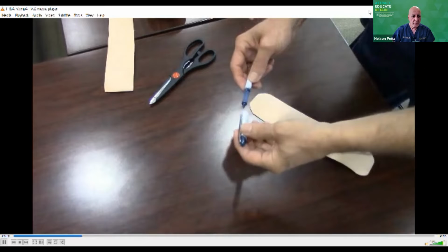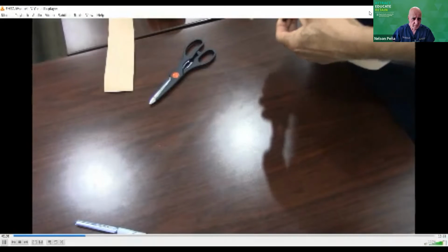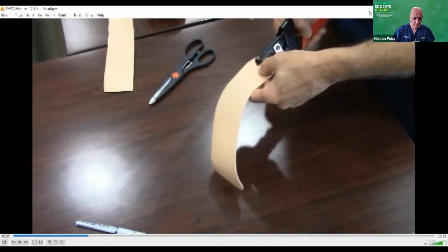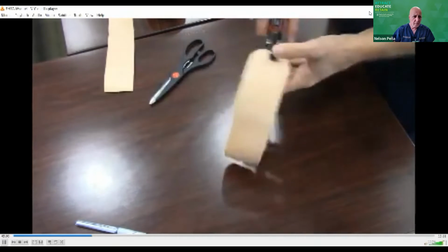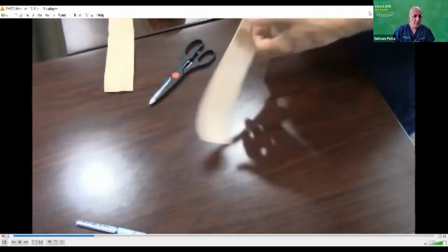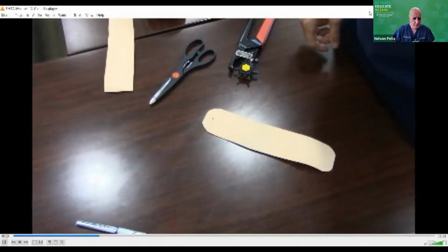Now once you have the strap cut, you want to take one end of it and put a hole in it where you're going to connect the snaps. I just got a handy hole puncher here that I use. However, there's nothing to prevent you from using a drill or even just a sharp object to create that opening. And then you punch the hole. And there's your hole. Now this gives me a place to put the snap.